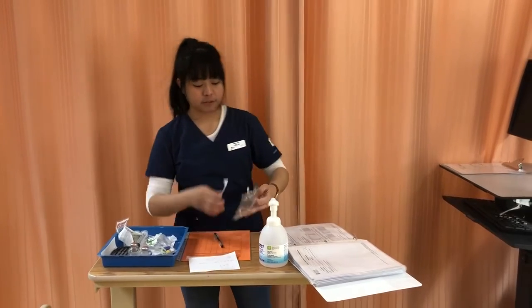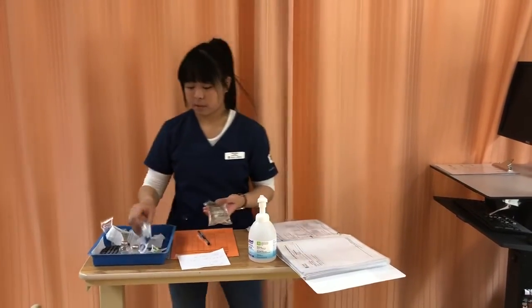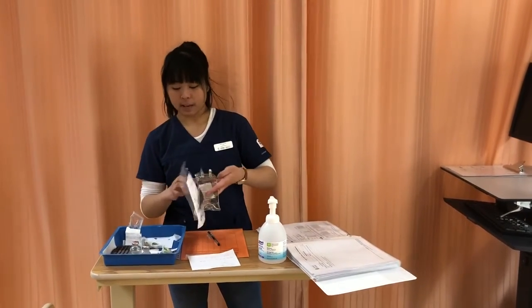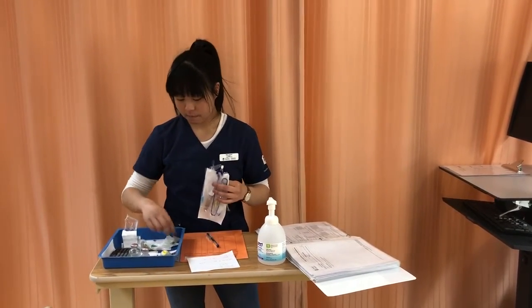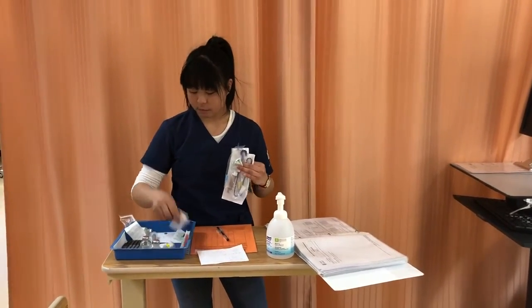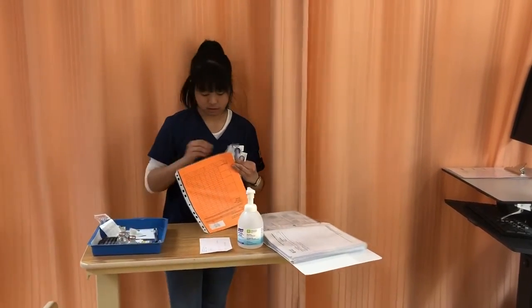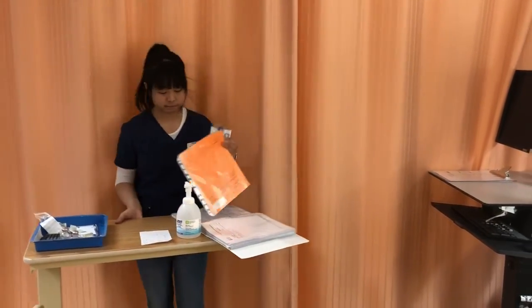We'll put it at the side of the bag that doesn't obscure anything. And so, before I go to the patient's bedside, I have my tubing with me for Piggyback, my alcohol swab right here, as well as my tubing label and my MAR. So now, I have it here.